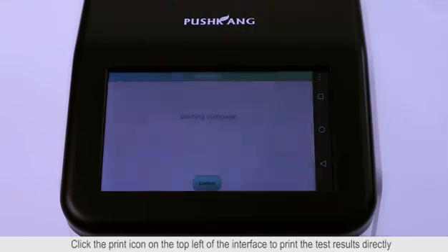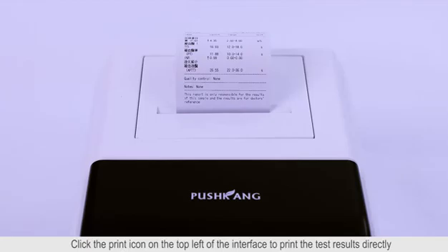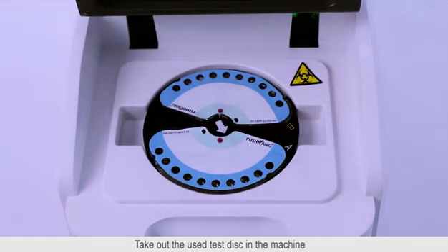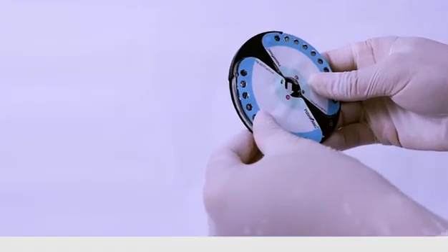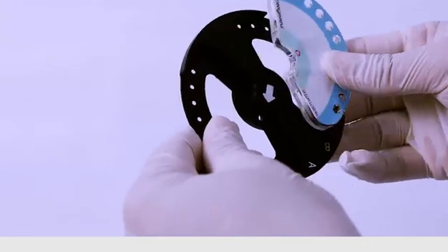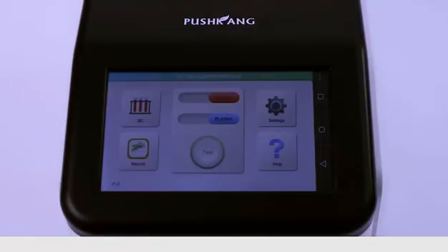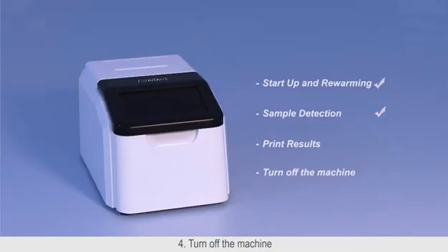Click the print icon on the top left of the interface to print the test results directly, then click OK after printing. Click Return, and take out the used tested disk from the machine and put it to the tray rack back. Close the cover and click OK. The whole process of coagulation detection is completed.